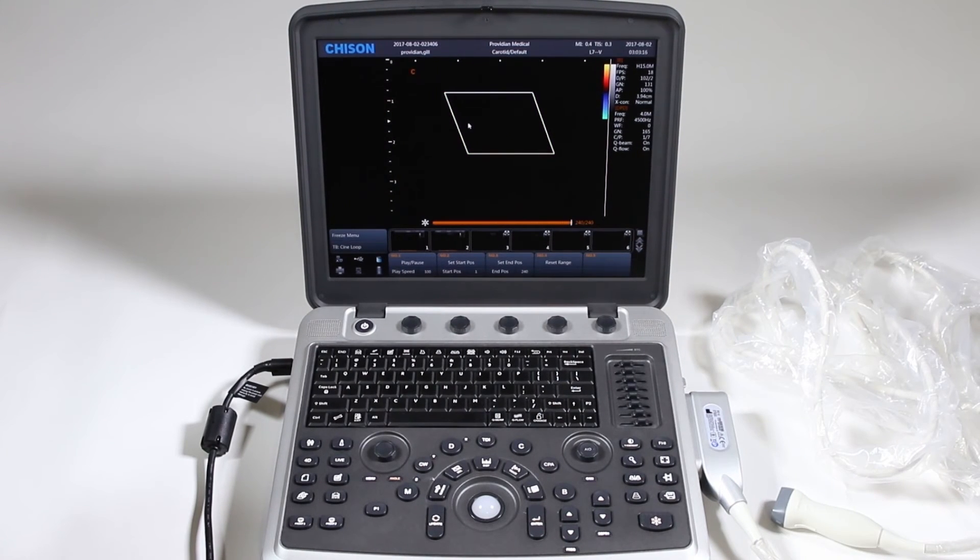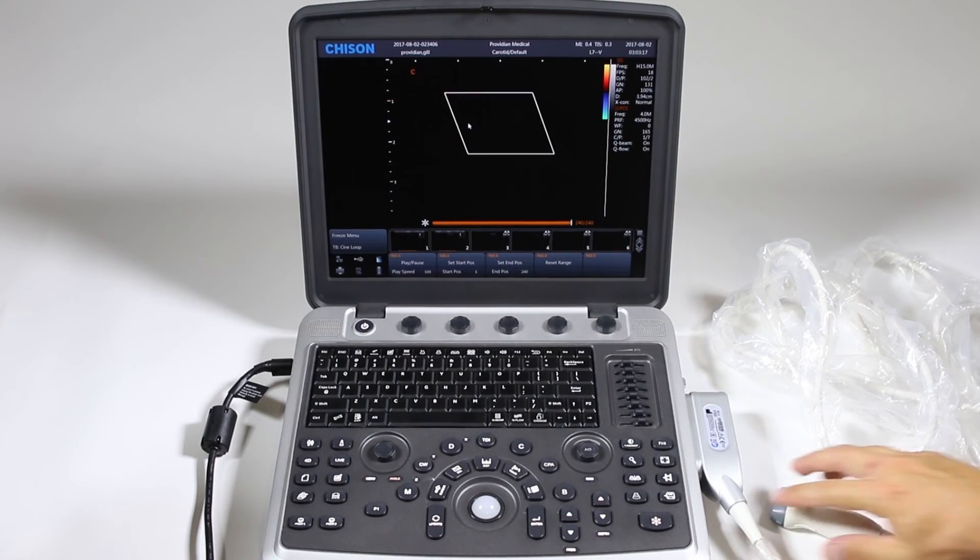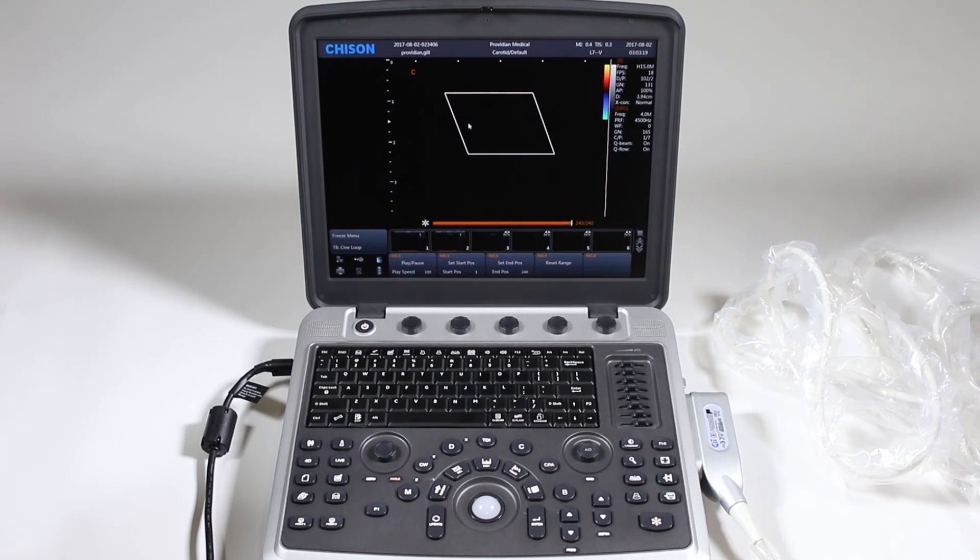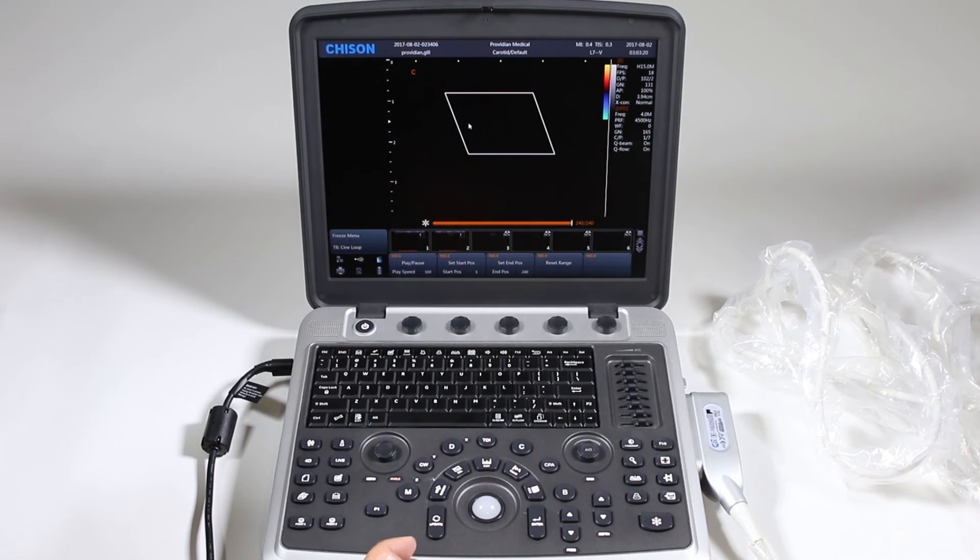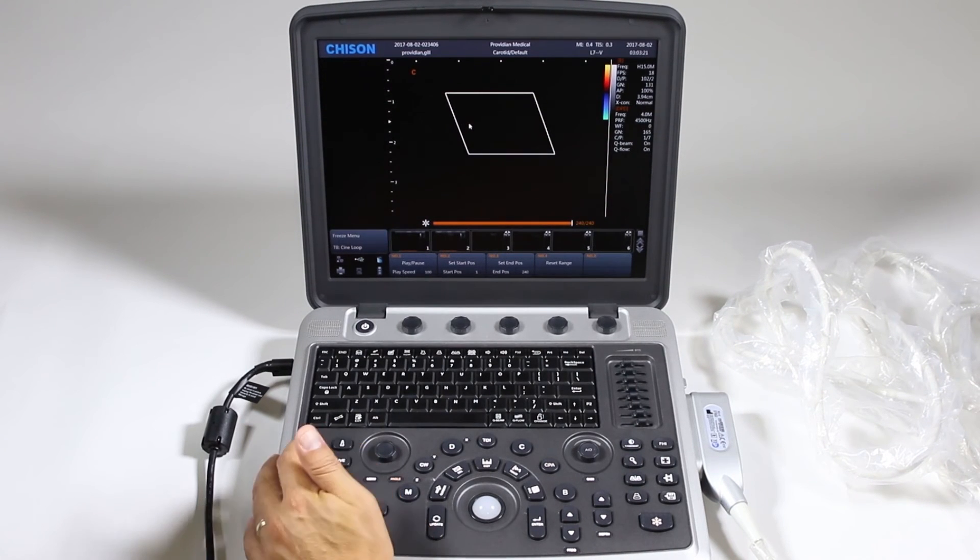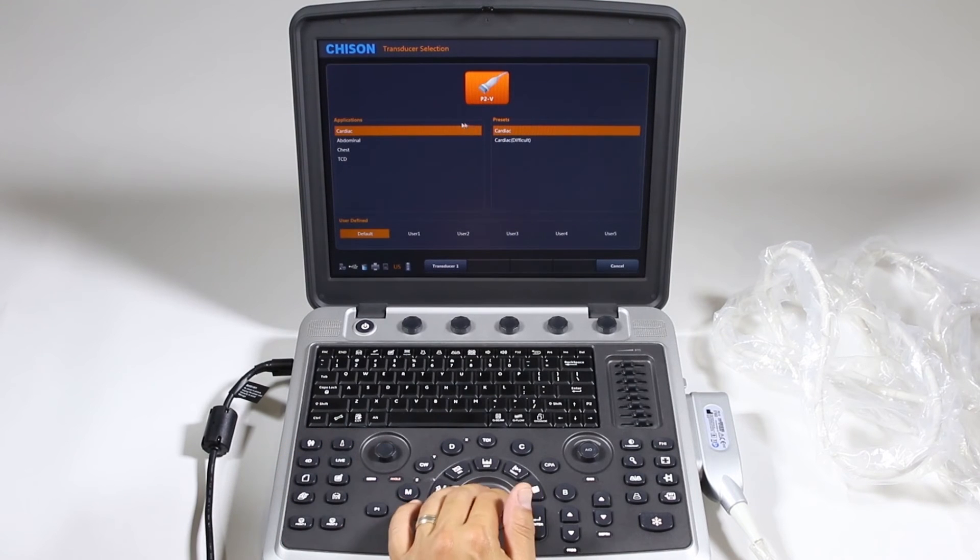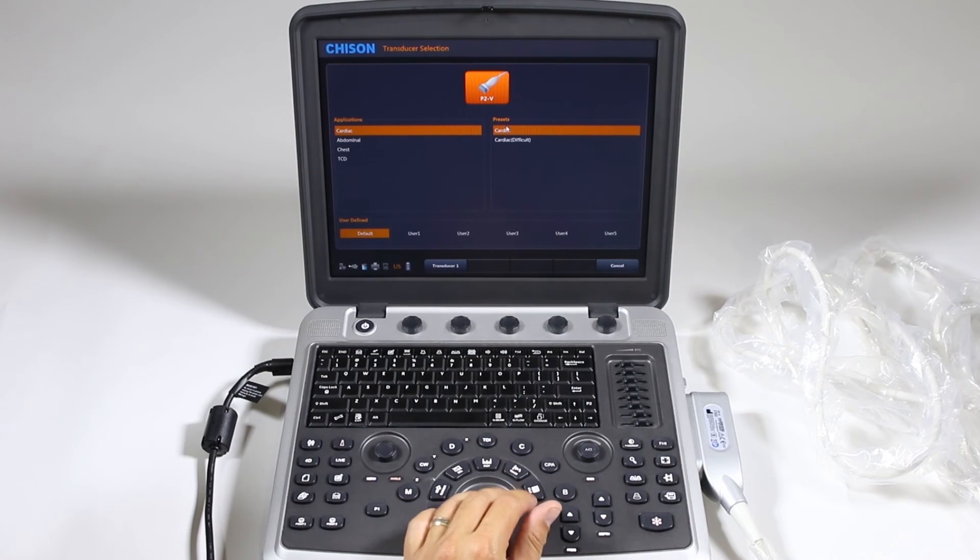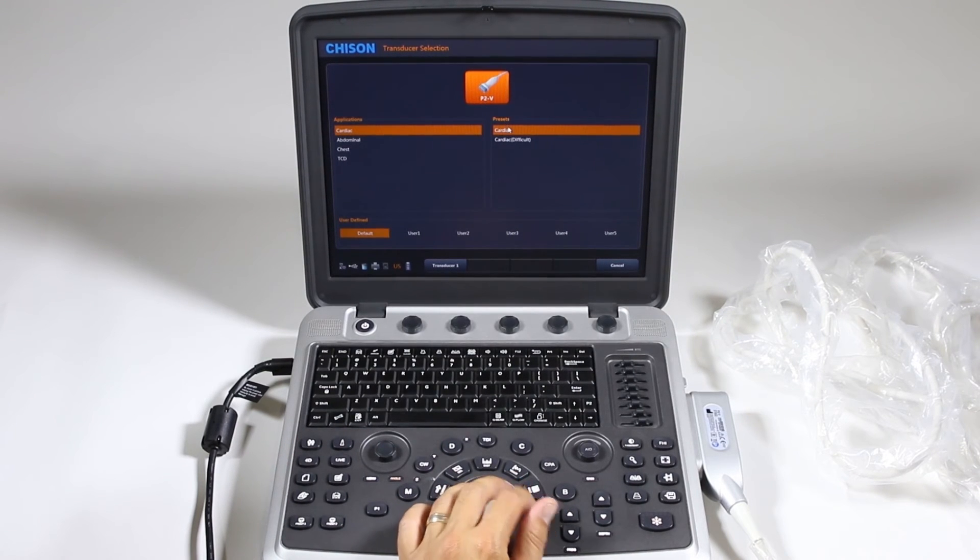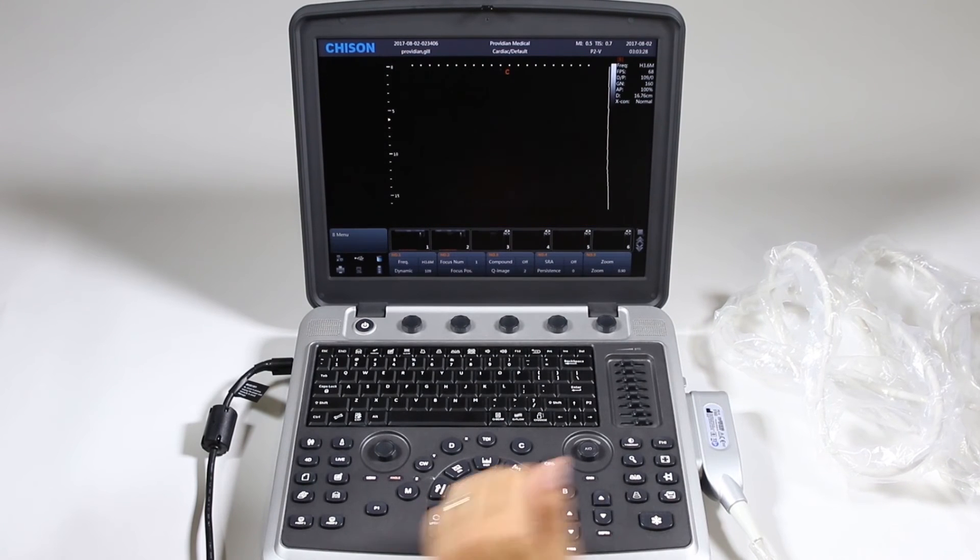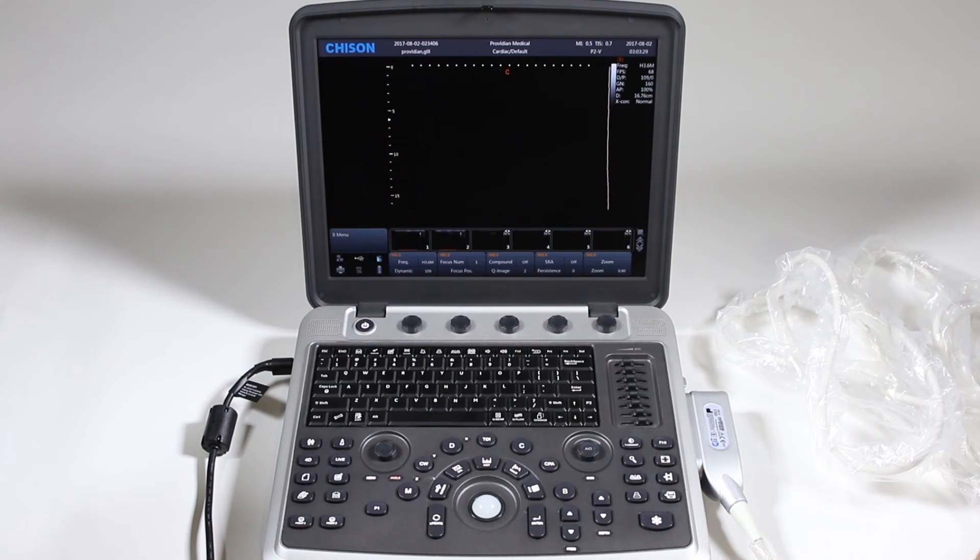I've gone ahead and changed probes now and I want to go to phased array to show CW Doppler. So I'm going to go ahead first and choose a new exam and go to this phased array probe.